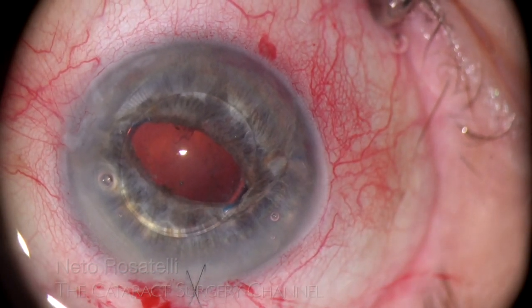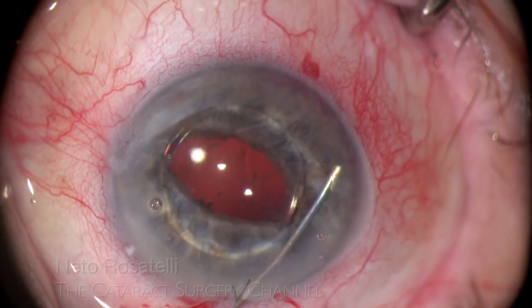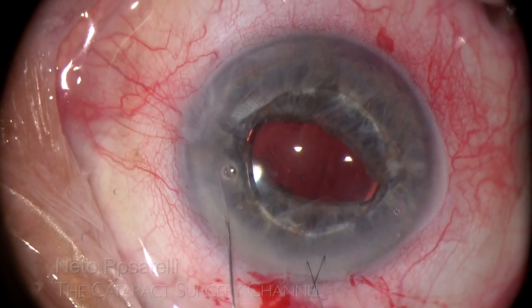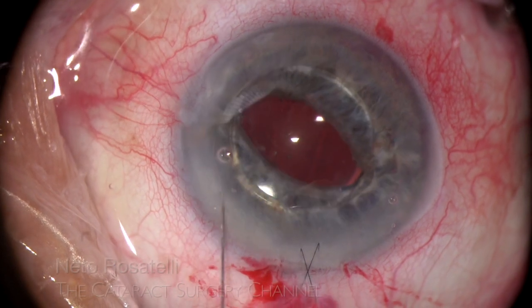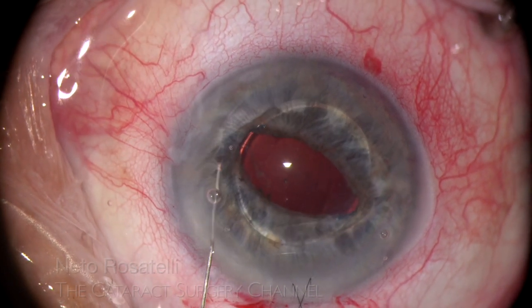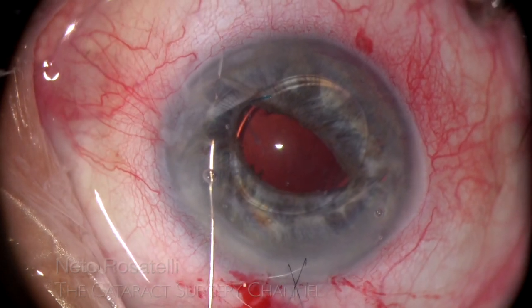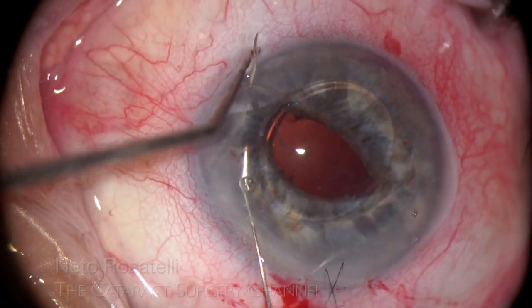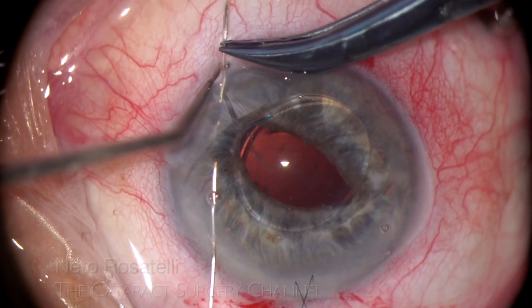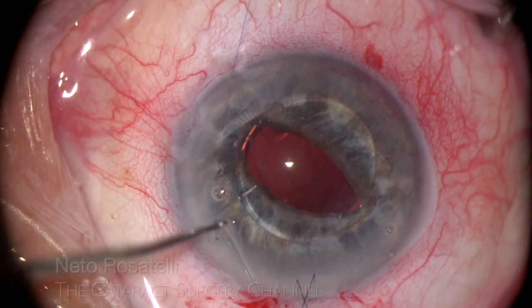The suture ends are trimmed one millimeter long. These suturing details are important to be followed, else incorrect iris suture tension will ensue. The knot is released from the paracentesis and I evaluate the suture to be a good one — mid-periphery, with enough iris tissue encompassed and not too tight. Perfect. The opposite suture is passed in a similar fashion. I think that a 2mm iris bite is ideal in this technique. The needle is retrieved and in this case I already cut the suture to length.